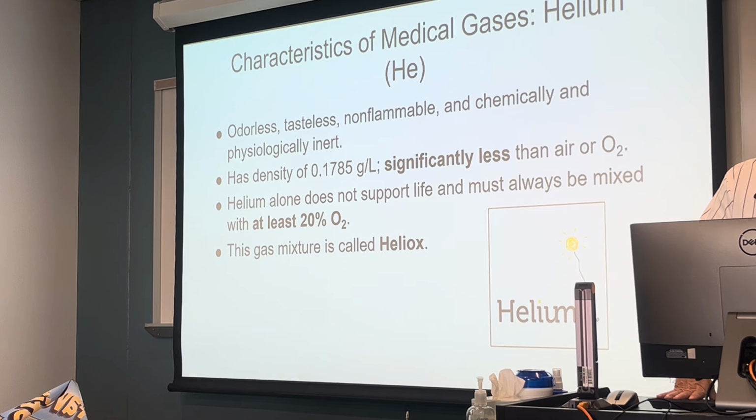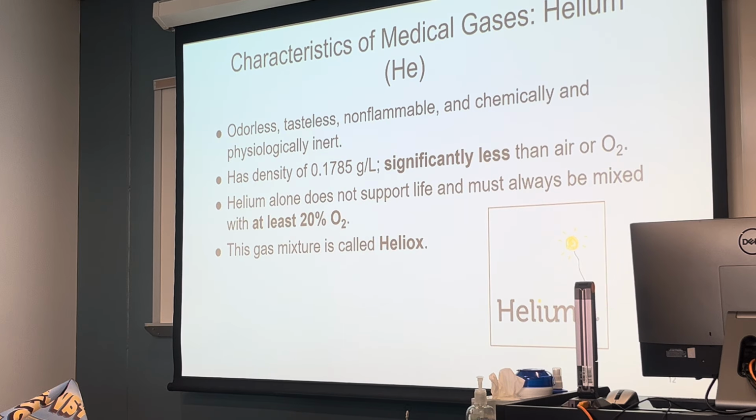Again, it doesn't support life. Helium alone does not support life; it must always be mixed with oxygen, with at least 20%. We can call it 21, but at least 20%.